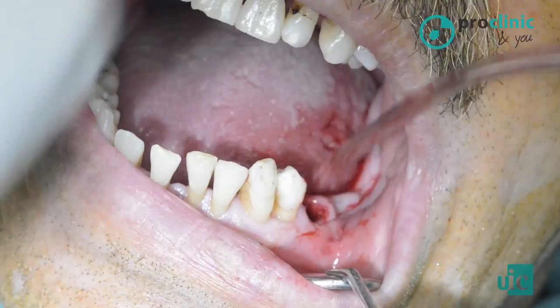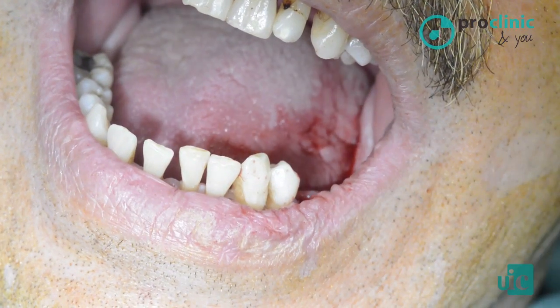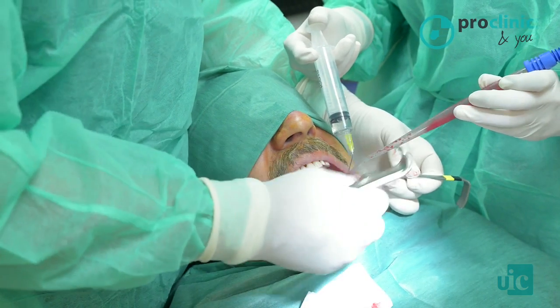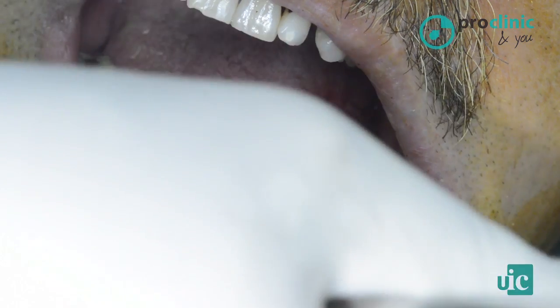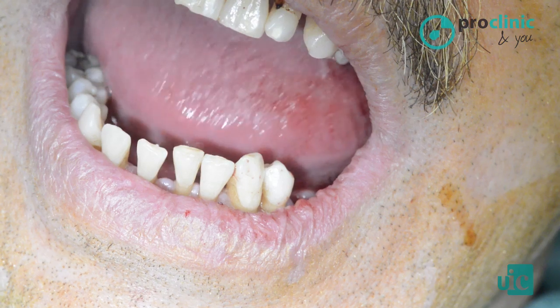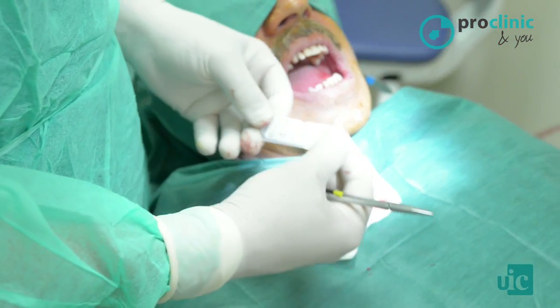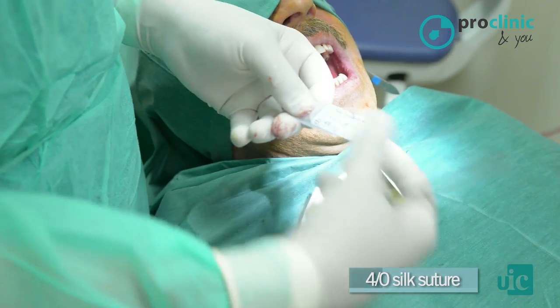Okay. Very good. We finish washing. We already use a Farabeuf retractor. Once the most part of the inflammatory tissue is removed, the bleeding usually stops. In this case, we will suture with a 4-0 silk suture, and a needle holder, obviously.